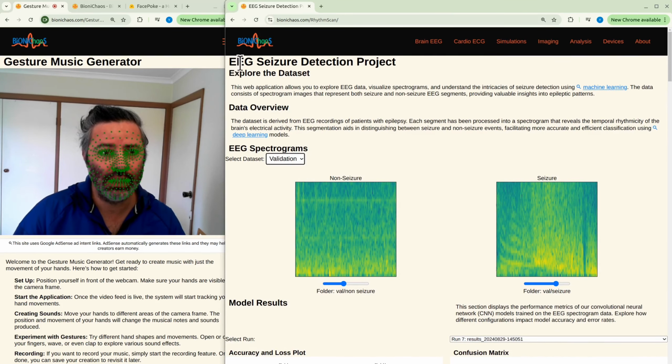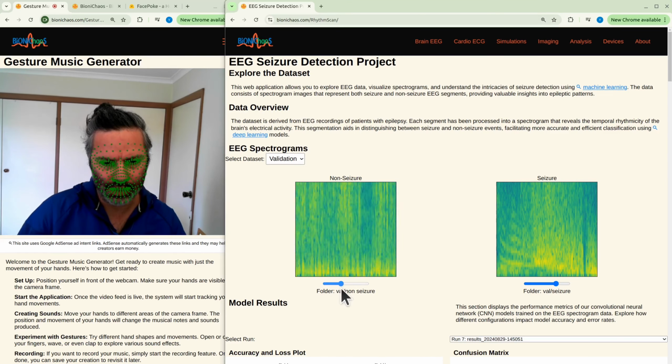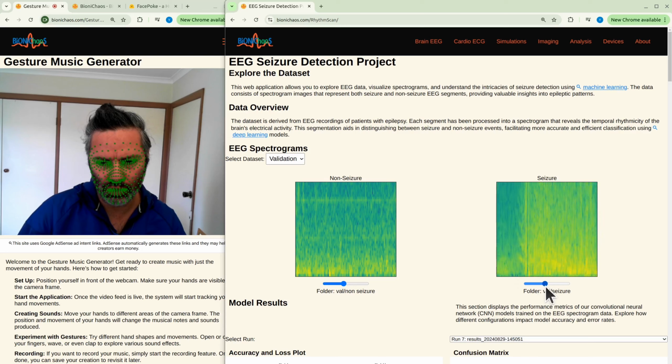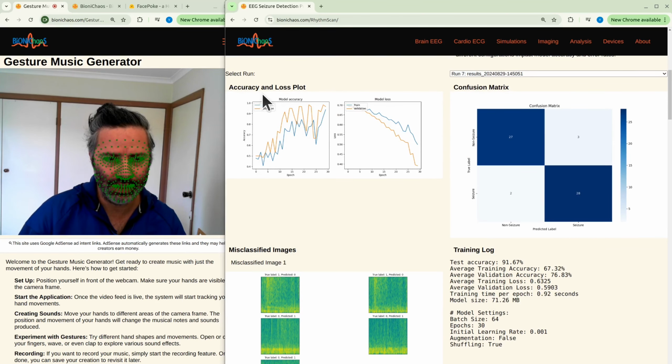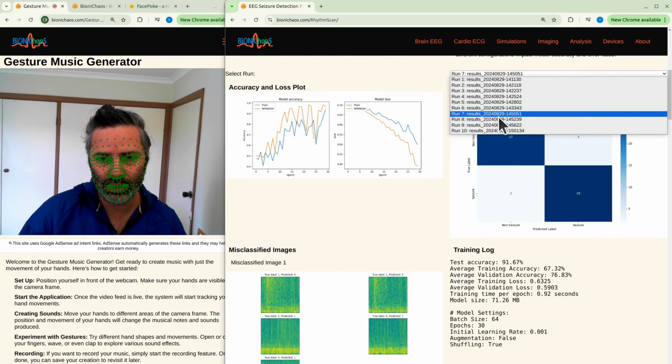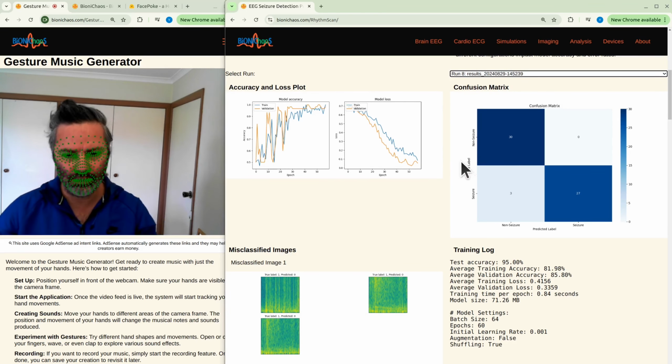Yeah, we're covering this EEG seizure detection project. It's up and running on the site. Then you can scroll through the data and see your accuracy, model accuracy and model loss functions. And we did 10 runs of training. Run 8 was even better than previous runs.